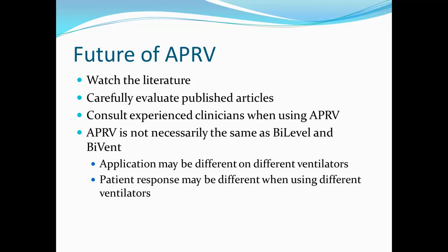Most of us have used volume AC, pressure AC, PRVC AC, SIMV, CPAP, pressure support, and most of those modes really are rather intuitive. APRV is not intuitive. I think that early on, in order to understand APRV, you need to work with a clinician who has a lot of experience with APRV. You need to read what you can. You need to talk to people about it to develop a sense of understanding of APRV and the clinical management of APRV.